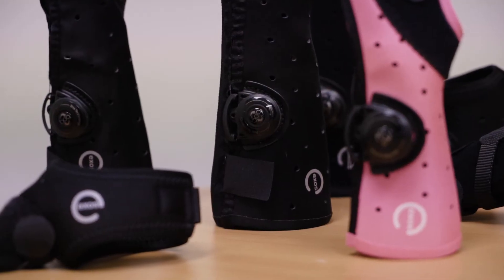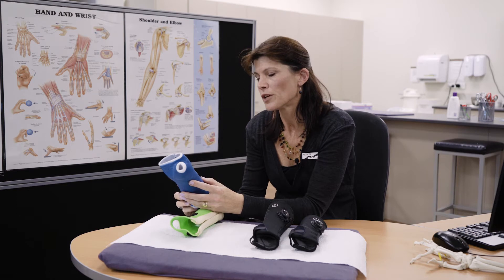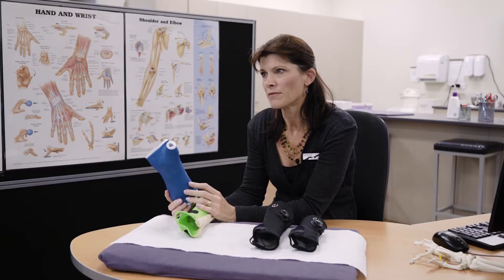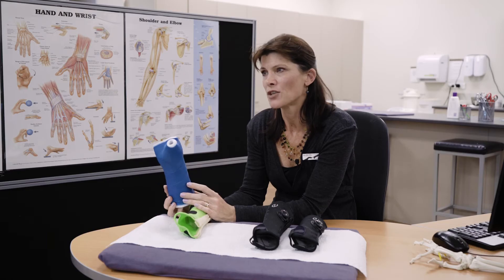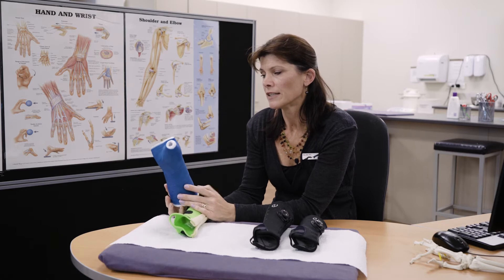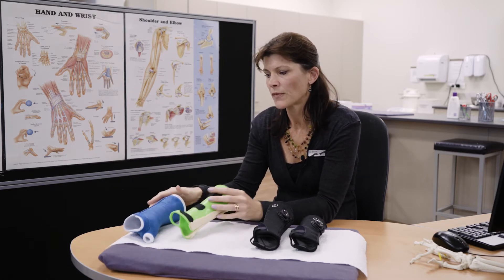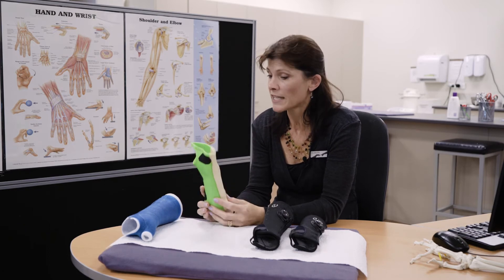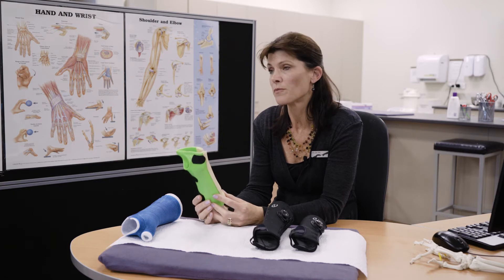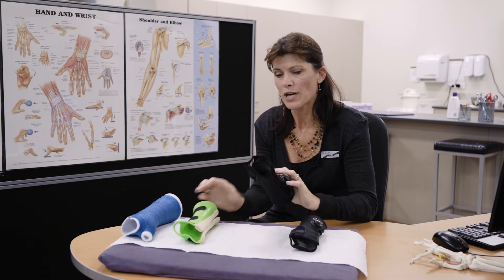Your options for a wrist sprain are: we could put you into a cast which we could split and strap for you, but it's not waterproof, it's fairly rigid, it's quite bulky, and it's not very hard-wearing. Alternatively, there's a thermoplastic option which is custom molded — a good option in terms of being able to get wet and being removable, but not quite as comfortable as the EXOS brace.